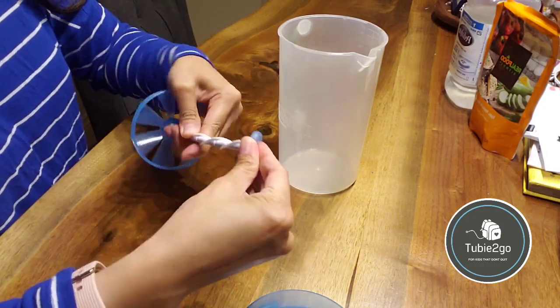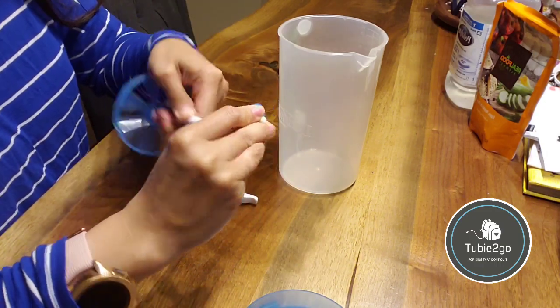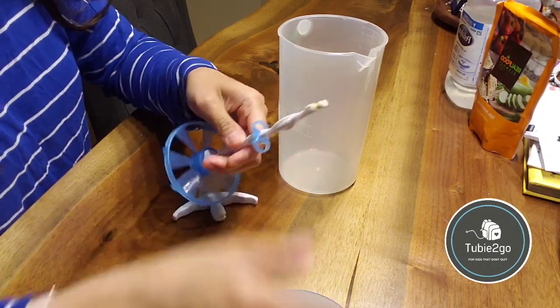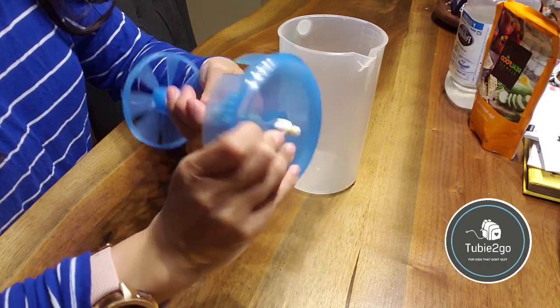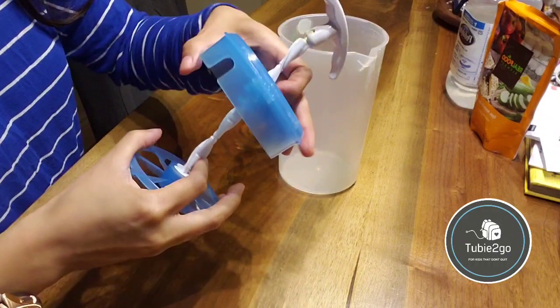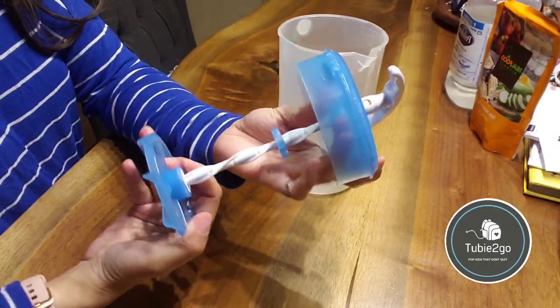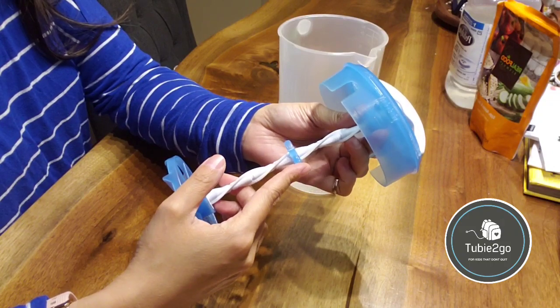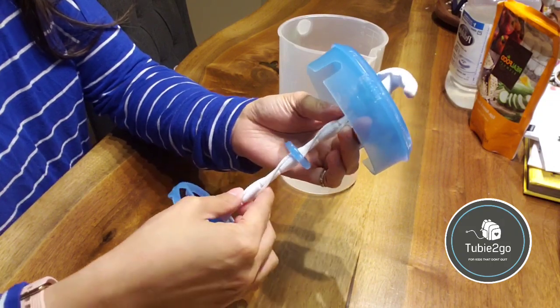There's a piece in here — this little stopper — that is adjustable along the length of the rod.